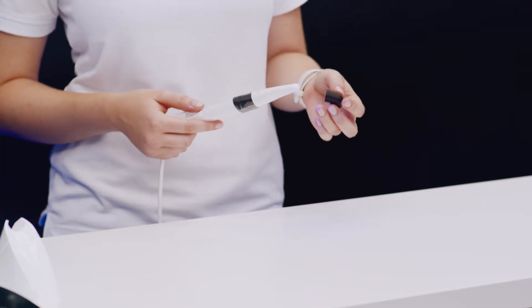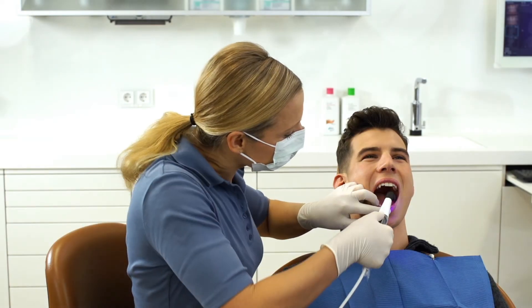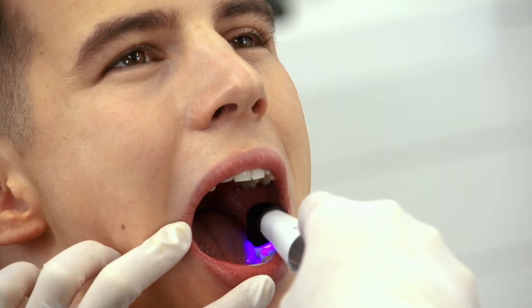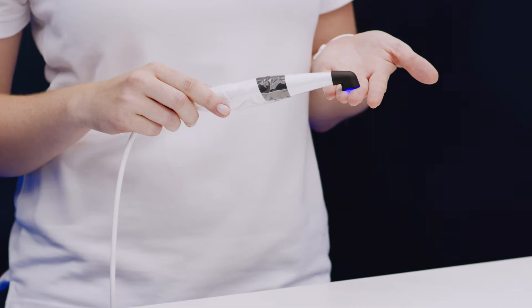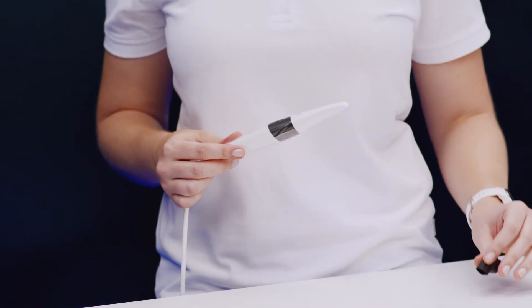Black spacers are available for the proof interchangeable head. These fit over the hygienic protective cover and screen out the ambient light. They also make positioning easier for you by sitting directly on the row of teeth. The predefined gap provided by the spacer means you will always get the same image detail, which will simplify follow-up appointments. And it goes without saying that you can reprocess the spacers for hygienic use.